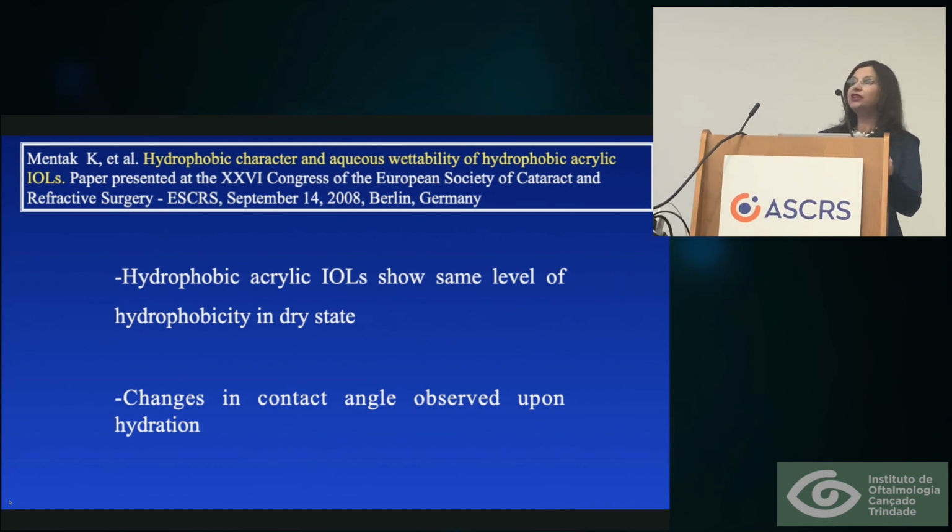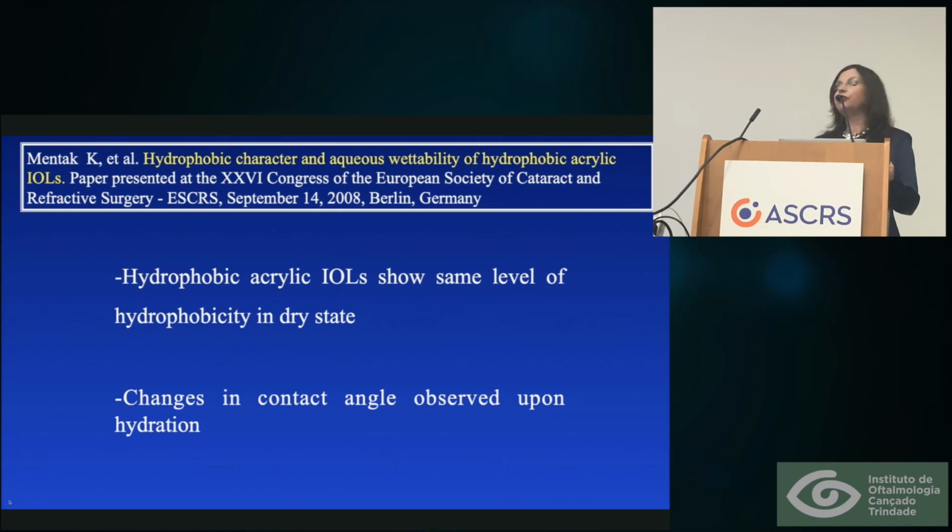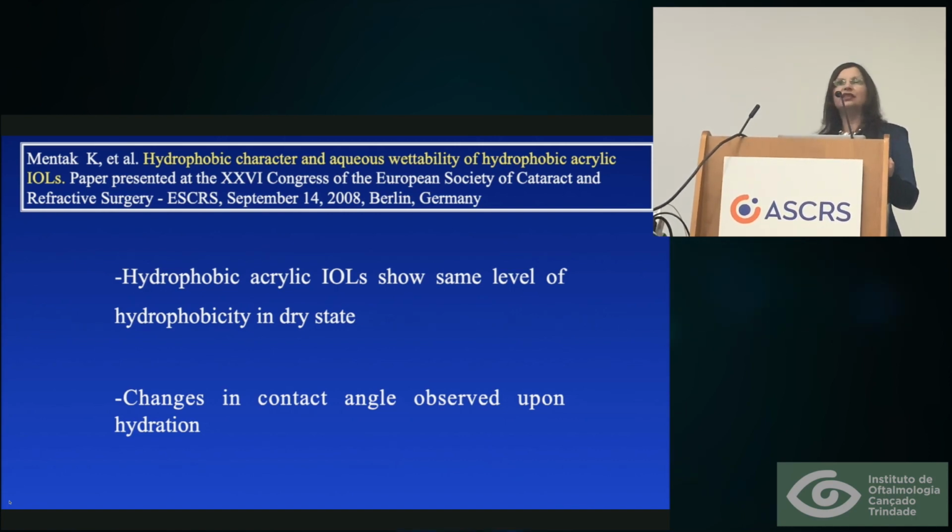And there is ample literature describing hydrophobic acrylic lenses implanted in the eye as piggyback lenses, not only hydrophobic acrylic lenses, but silicone lenses, which is also a hydrophobic material. And there is no particular problem related to the material. So the material does not appear to be a very fundamental factor.